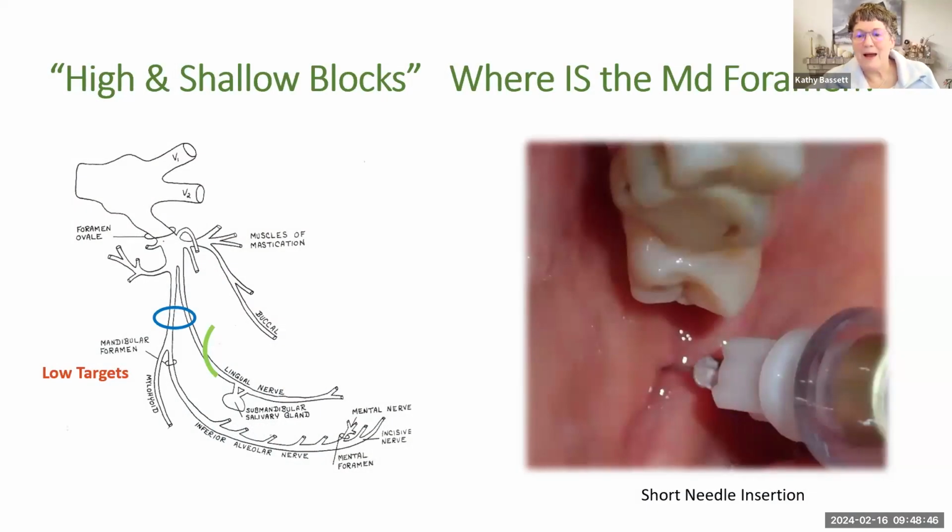This brings us back to the discussion of depth of needle insertion and the question of the use of a long needle versus a short needle for an inferior alveolar injection. For some, you almost feel like you're being sacrilegious to even propose a short needle. But I'm going to show you some data that is a reasonable rationale for the choice of a short needle.